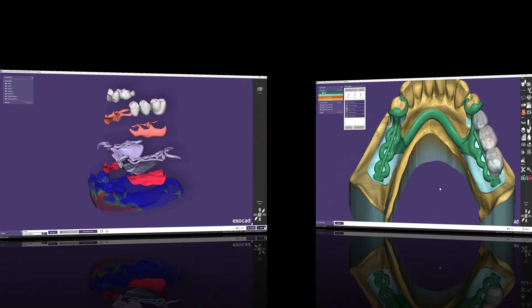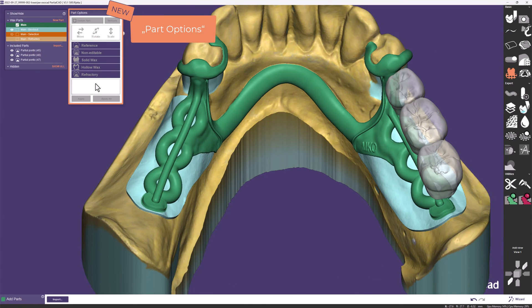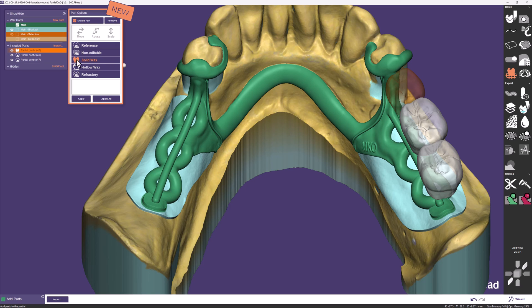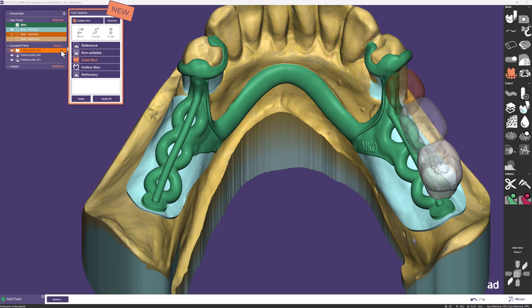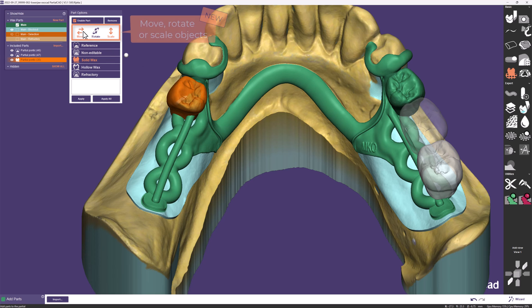Opening another case and jumping to Add Parts, this step includes a new window called Part Options, which lists all imported files from the DentalCAD. Here you can enable or remove parts and decide the role each part plays in your design. Selecting an element highlights it in orange, and you can choose whether it should be a reference, non-editable, solid, hollow wax, or part of your refractory. You can also right-click on the part inside the show/hide menu. After importing parts manually, the ability to move, rotate, or scale objects is also new.